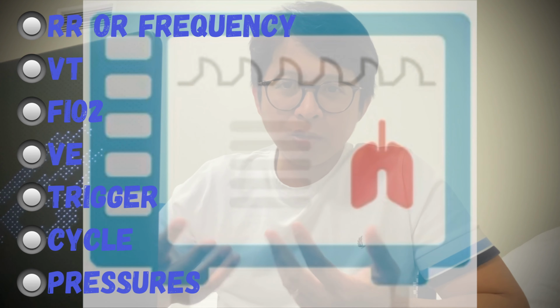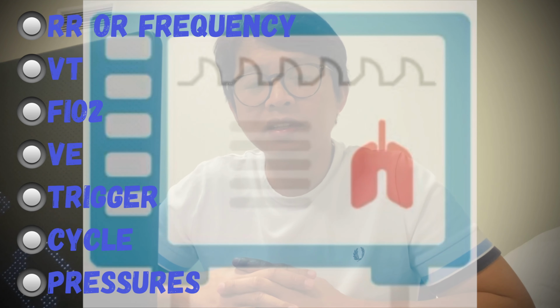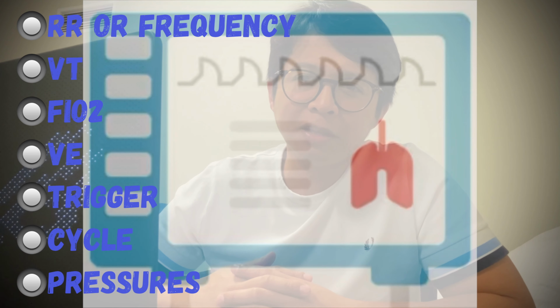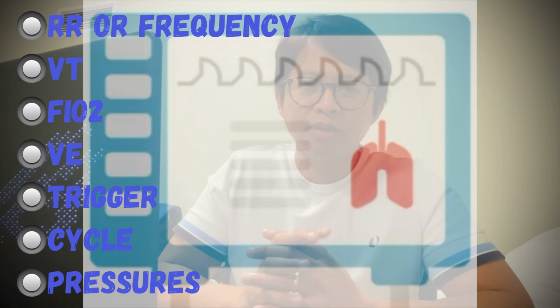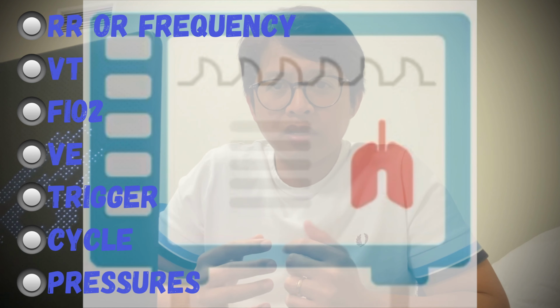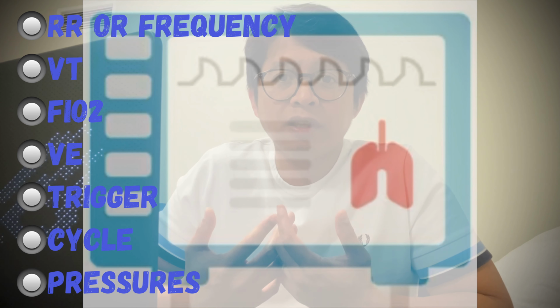I hope you followed. I believe that the information I've mentioned is the most essential in understanding mechanical ventilation. You will not be competent in handling a mechanically ventilated patient if you don't know this. Otherwise, when you see a patient having a respiratory rate of 10 but the tidal volume is 500 ml, you will call the doctor or the respiratory therapist and say, my patient is hypoventilating. Well, that is not hypoventilating, because 10 times 500 is 5,000 or 5 liters. It is very good minute ventilation or volume.